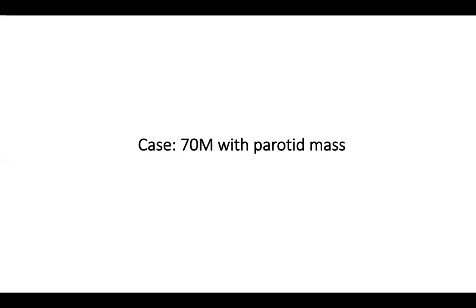Because sometimes if you do just one stain, like I know some people who say, oh, I just throw an SMA on it. If it's negative, I know they're not myoepithelial cells. But that's not really true. You have to throw a bunch of stains on them.